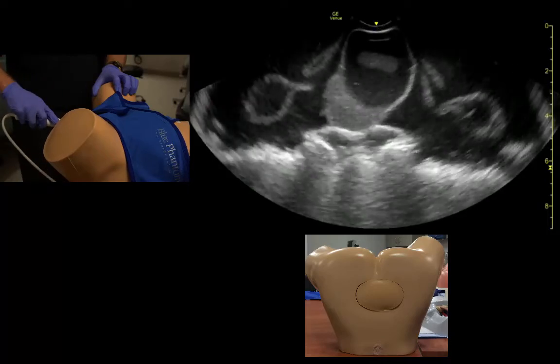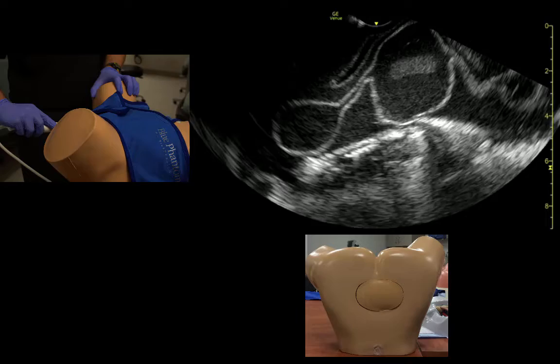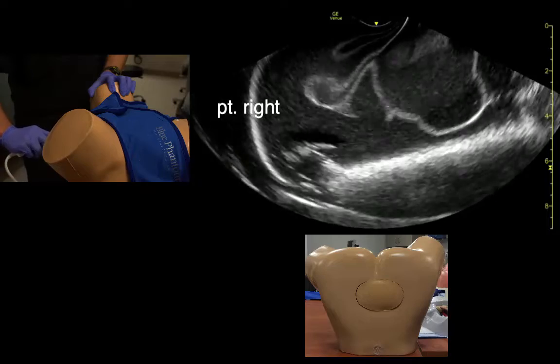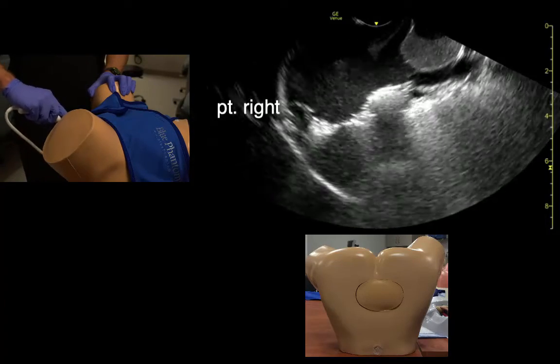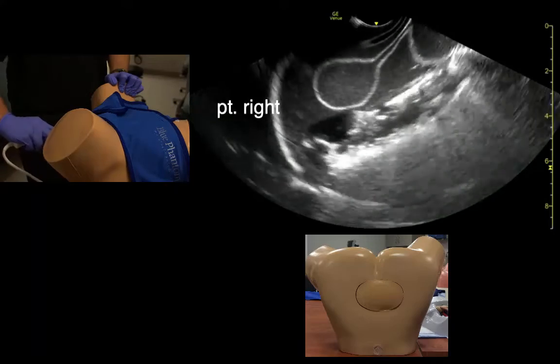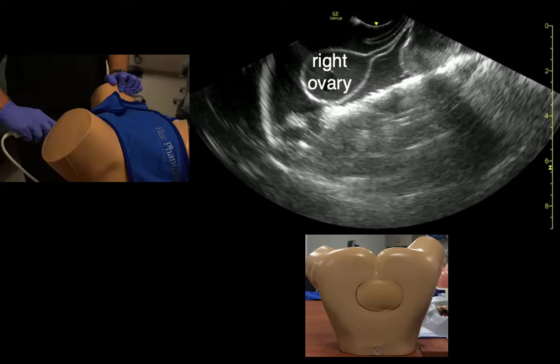To identify the adnexa and ovaries, we come to the midline and fan over to one side. We need to apply some pressure into the lateral fornix and fan from ceiling to floor to examine the ovary and adnexa completely until they disappear in each orientation — disappearing towards the ceiling and disappearing towards the floor. If we need to apply color Doppler or anything, we could do that.